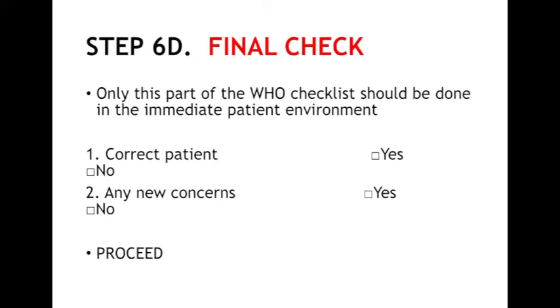At this point, the ventilation strategy changes to low frequency, low pressure, fixed volume, and repeat subglottic suctioning is performed. The oral endotracheal tube is advanced. Up until this point, there is no viral load within the surgical field, except any from a hematogenous source.